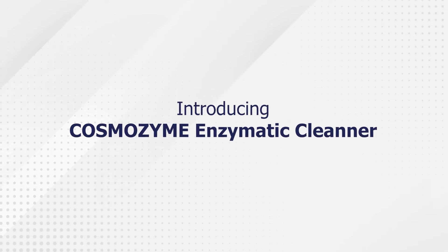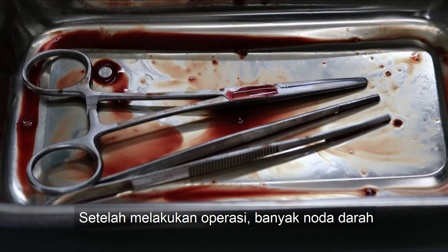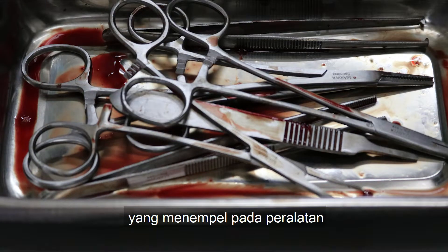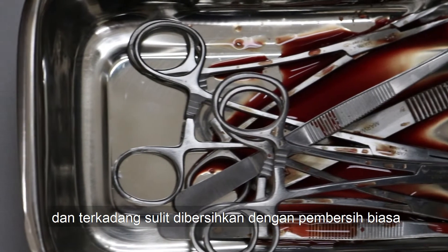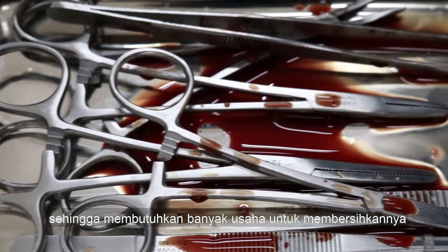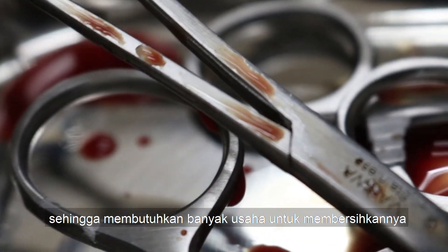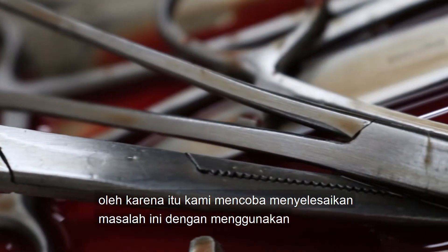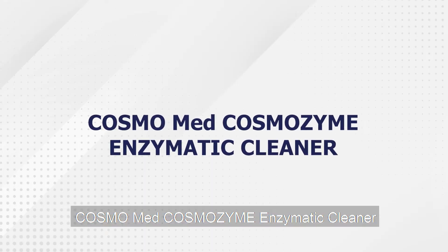Introducing Cosmozyme Enzymatic Cleaner. After surgery, a large amount of blood stains stick to the equipment, and sometimes it's difficult to clean with ordinary cleaners, so it requires more effort to clean. Therefore, we try to solve this problem by using Cosmozyme Enzymatic Cleaner.